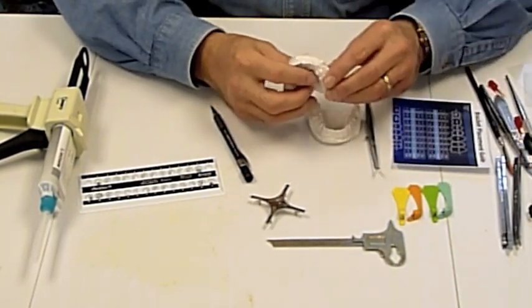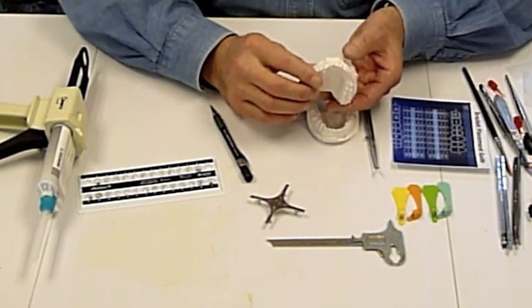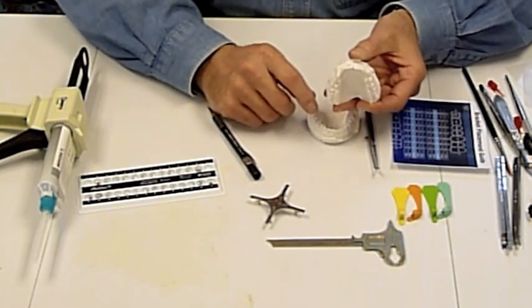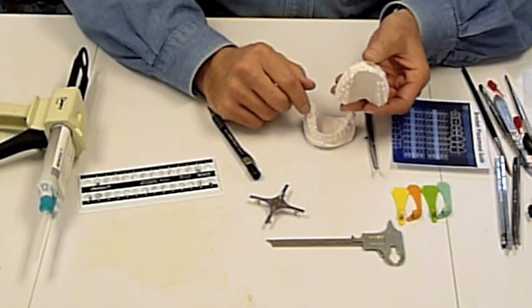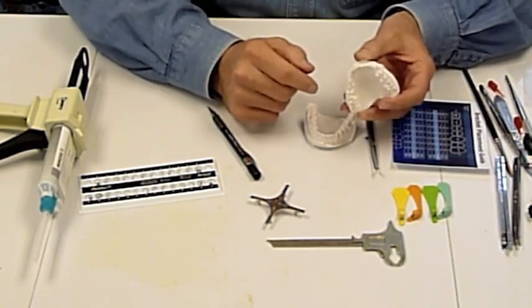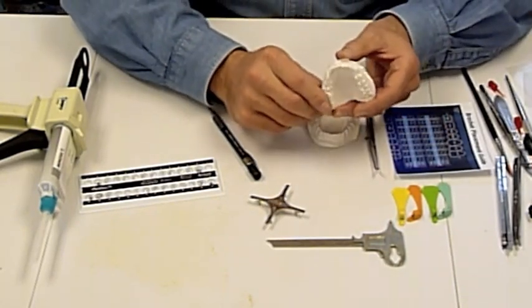In order to determine the placement of the brackets on the teeth, we take a look at the incisors and determine the midpoint of the teeth and the exposure of the central and lateral incisors. For this patient, we're going to choose four and a half as a position for the centrals, four for the laterals, and follow the guide for the placement of the bicuspids and the molars.